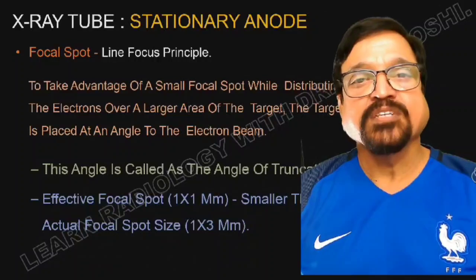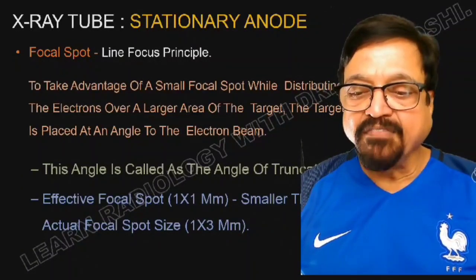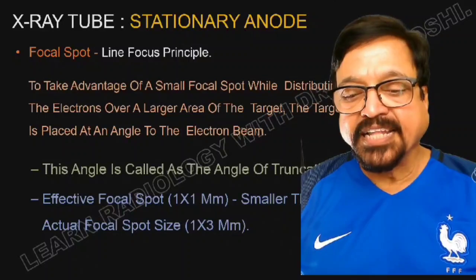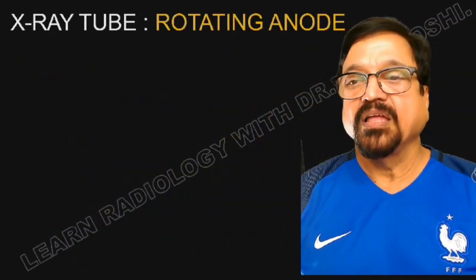This angle is called the angle of truncation. That is 20 degrees. Some machines have 15 also. Both are correct. 15 is also correct, 20 is also correct. The effective focal spot is smaller than the actual focal spot.